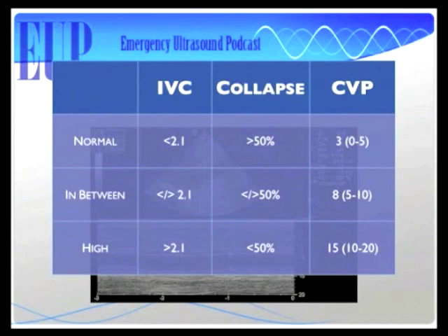Well, how could I use this IVC? I think what you're getting at is the principle of just looking at the collapse of the IVC. Is that what you're looking at? Okay, so if it was collapsing more than 50%, I would give fluid or wouldn't give fluid then? If it's collapsing more than 50%, then your central venous pressure is probably pretty low. They need more preload, so you give them fluid. But if it was distended and not collapsing at all, they're probably not going to respond to fluid.